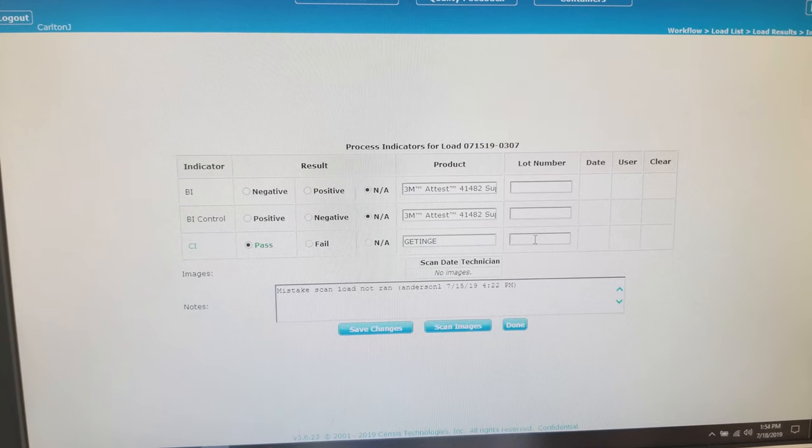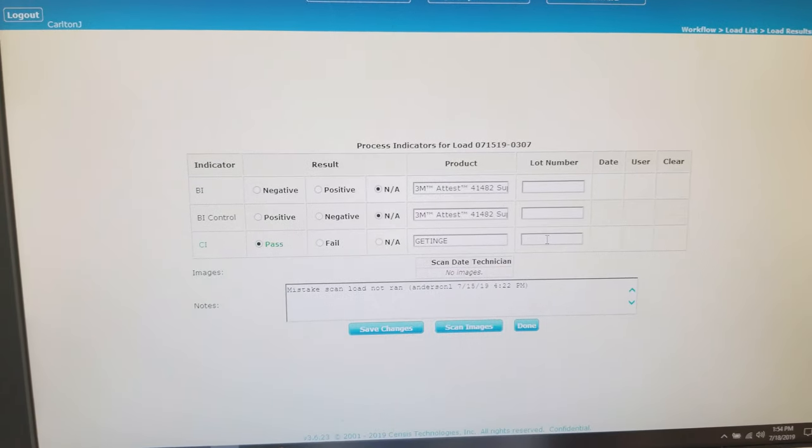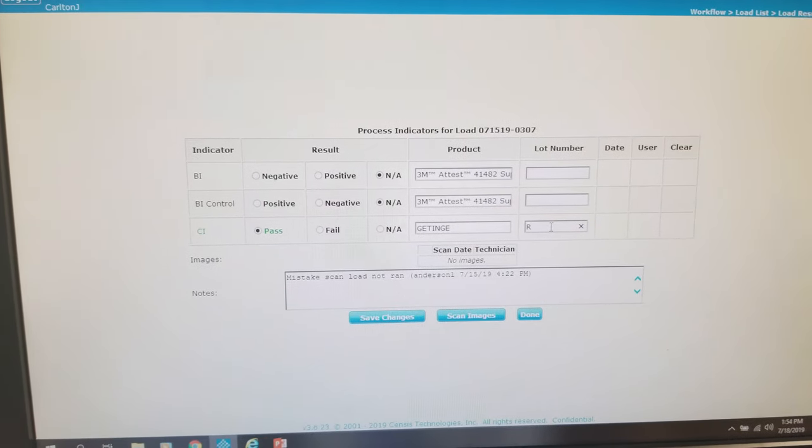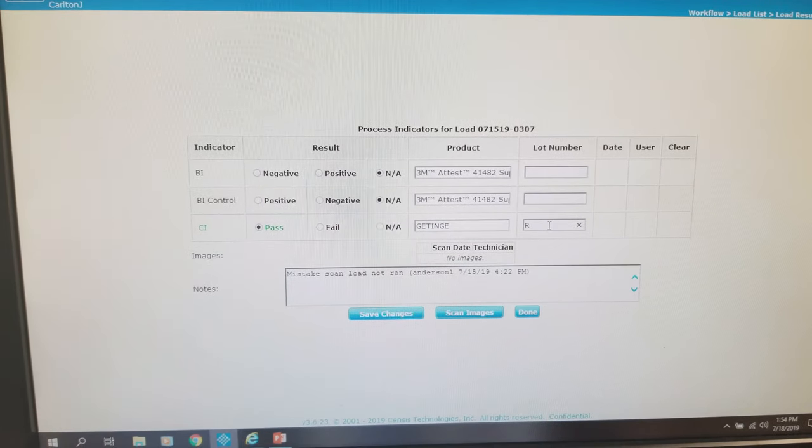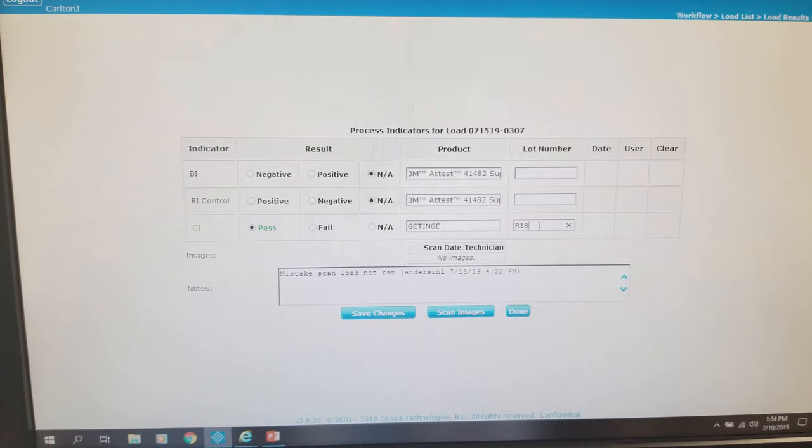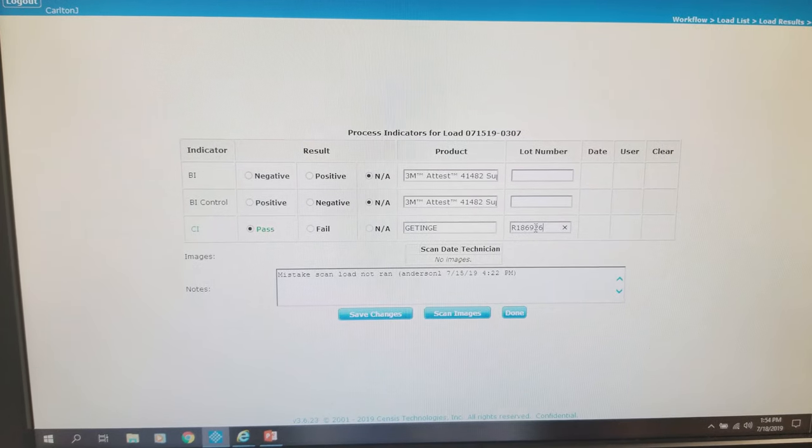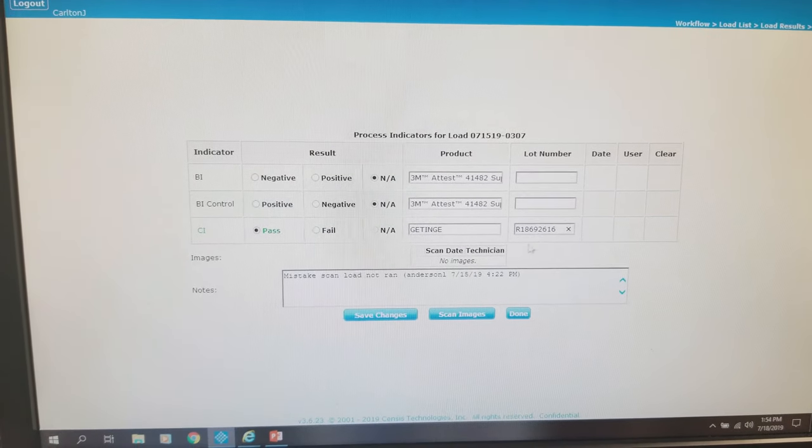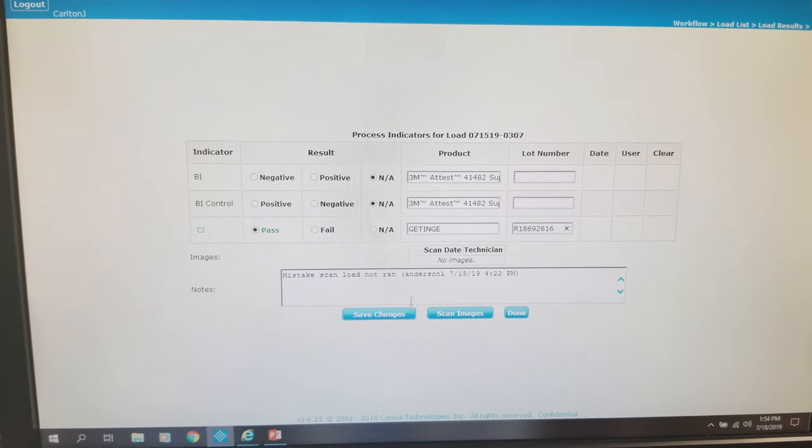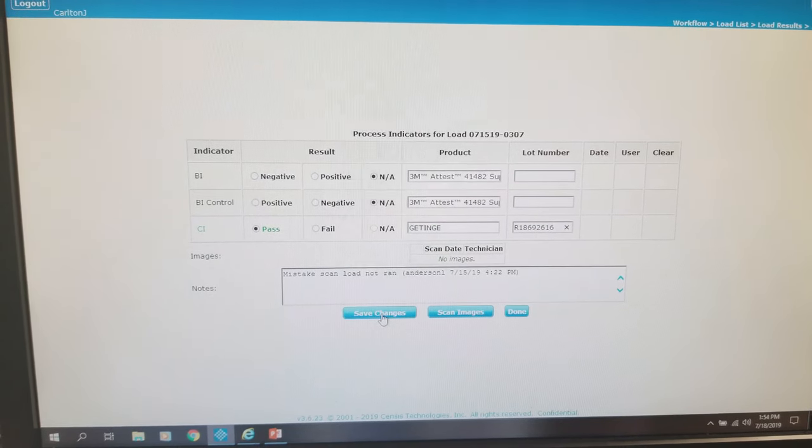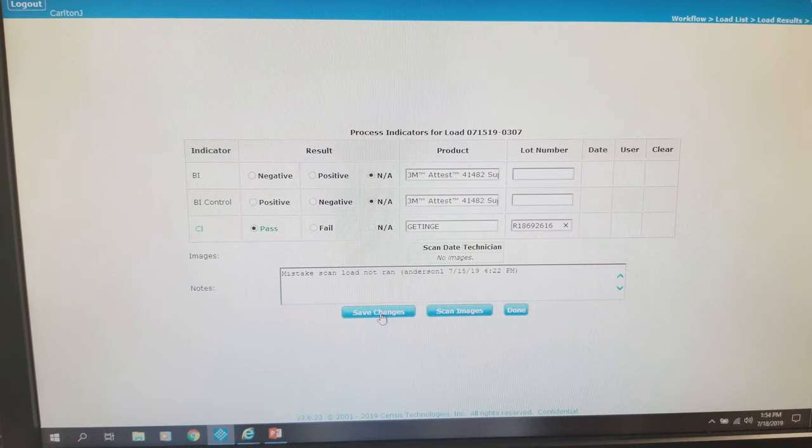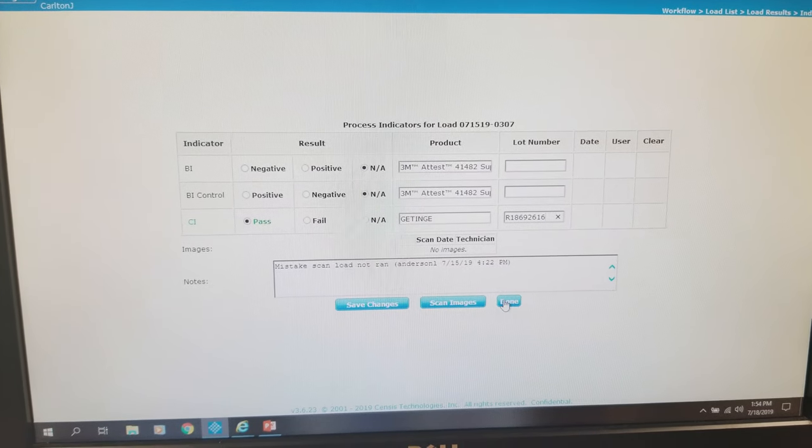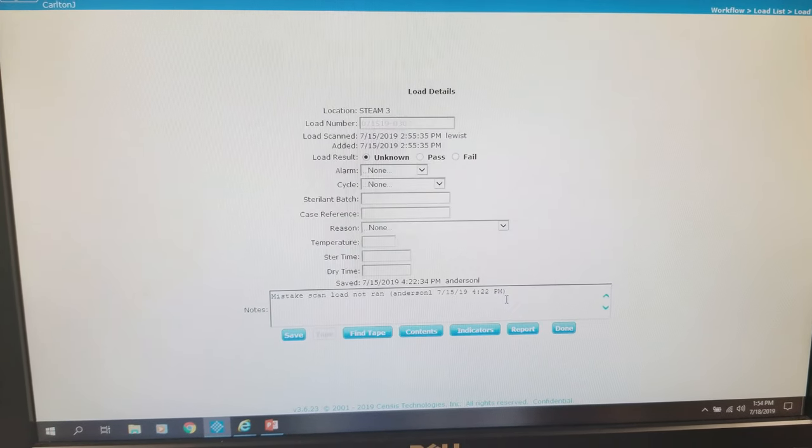Now we want to go to our indicators page and select NA, NA as we have not run a biological. Then we want to click pass or fail for our CI and put in our lot number on our CI, and then click save.